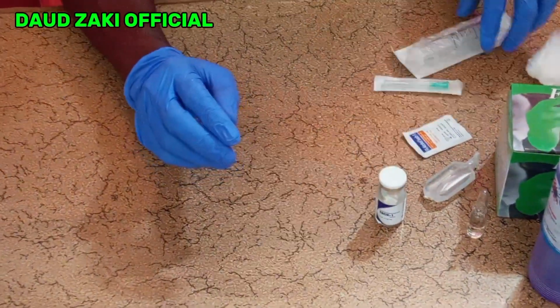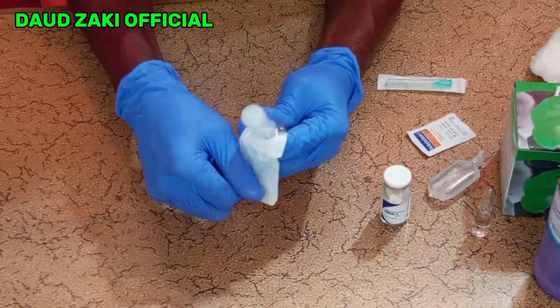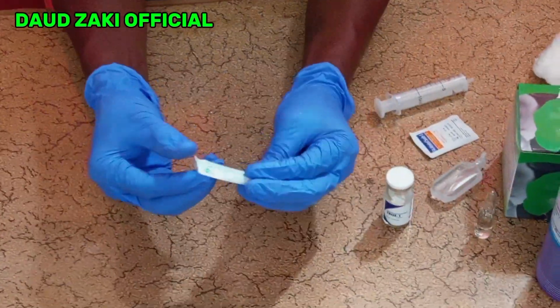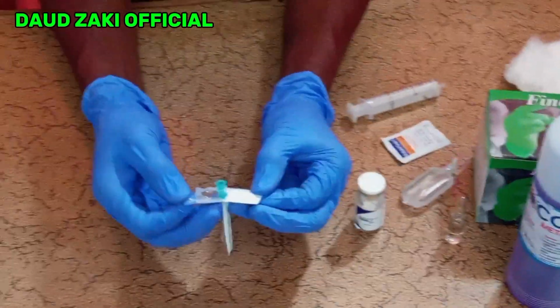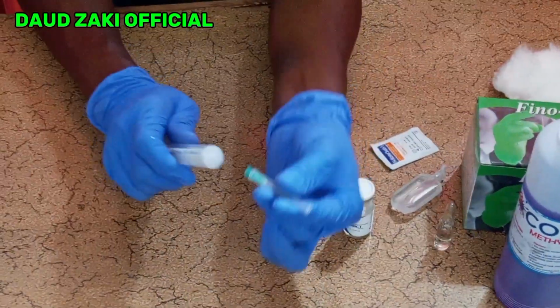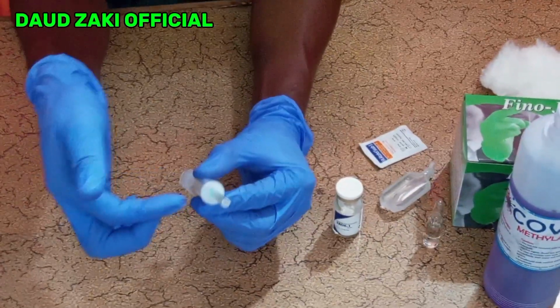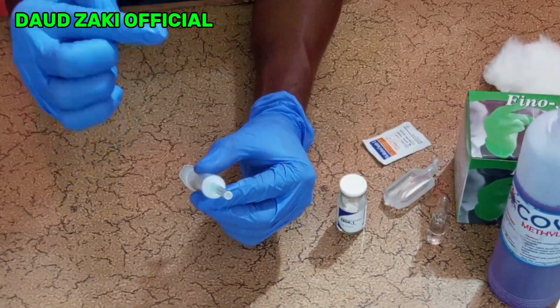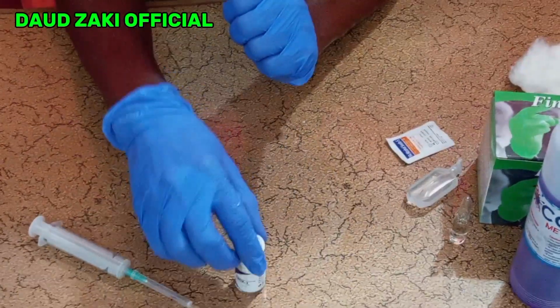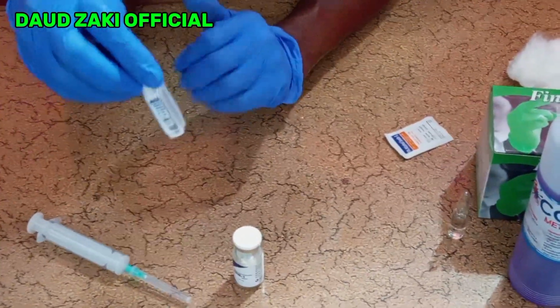Then you have to get a syringe. You remove the syringe from the manufacturer's packaging. Okay, you will get a 21 gauge needle. You open the needle from the manufacturer's packaging, then you attach the needle to the syringe. Always avoid touching the needle with your fingers. So this is a vial, and we also have sterile water for injection that is 10 ml.